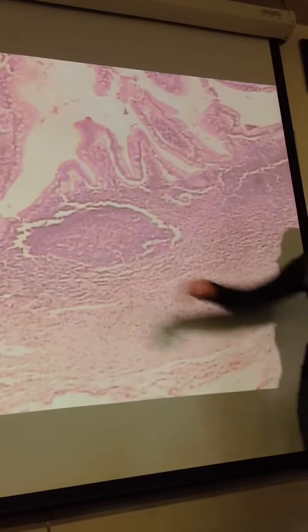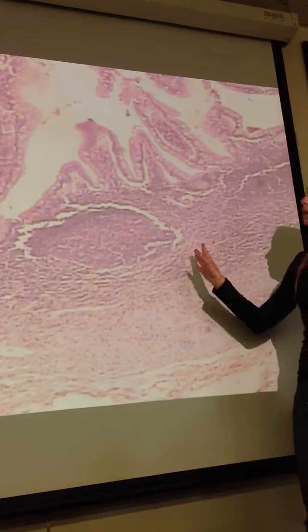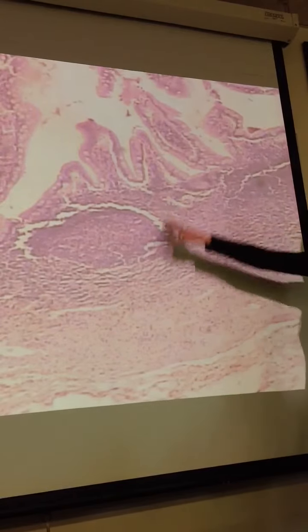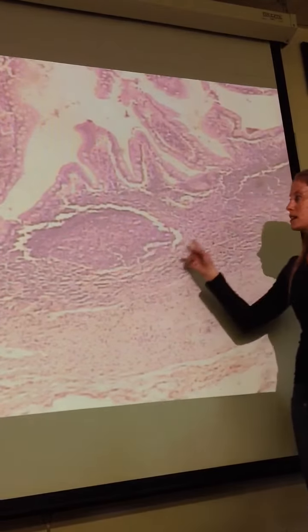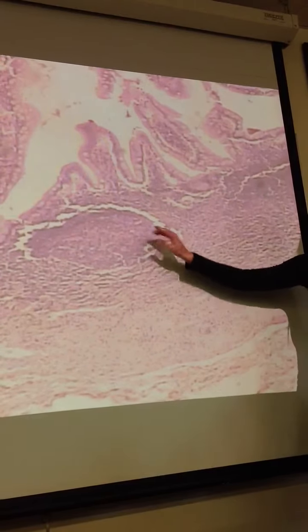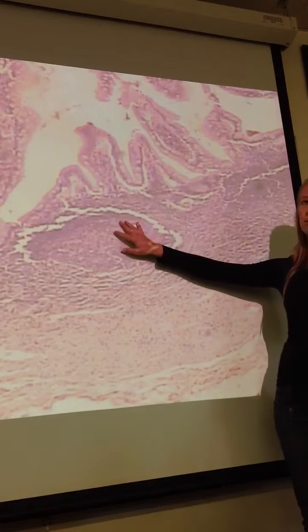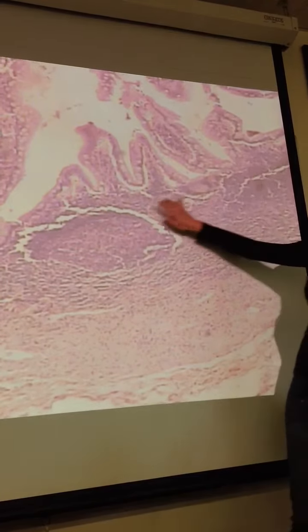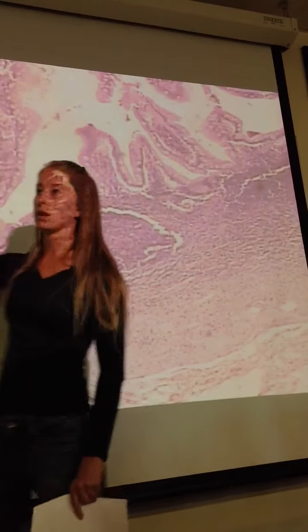So you don't have as many villi or anything else, which is why we're not really covering those here, and you only need some of the duodenum. But in the submucosa, which is all of this, we have Peyer's patches. So this big purple mass, that's a Peyer's patch, again found in the submucosa, okay? Don't let this throw you off because that's such a small mucosa and make you think that this is still part of the mucosa. This is about the line that you can draw for the submucosa versus the mucosa, okay?